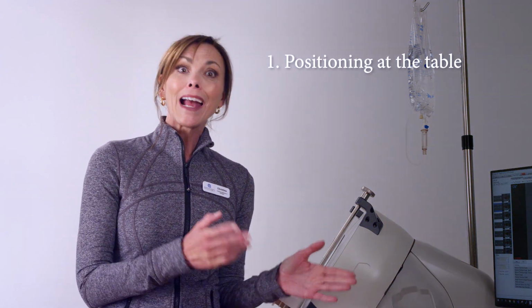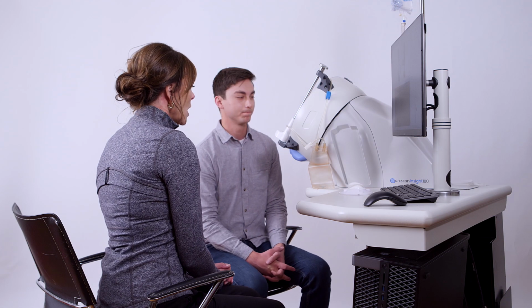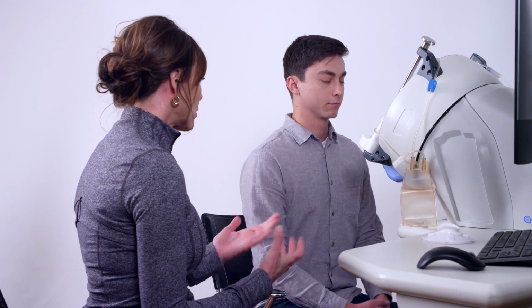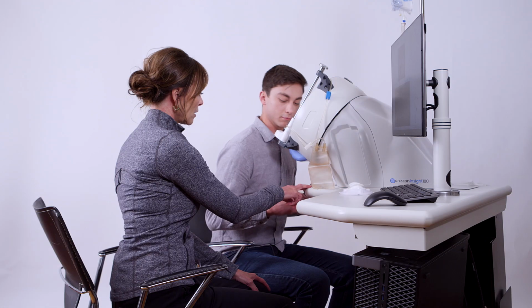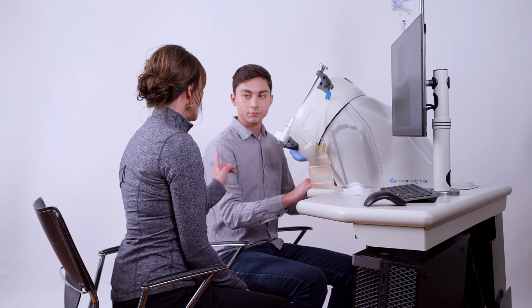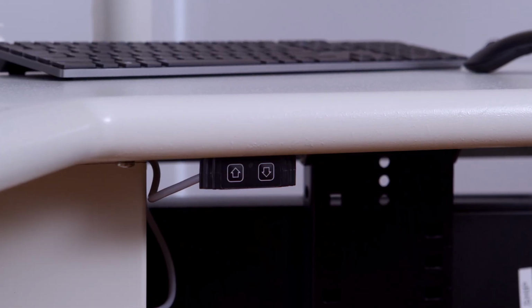There are two aspects to good patient positioning, a key to capturing the images that you want: positioning at the table and positioning at the EyeSeal. Generally, the patient should have good posture and lean in from the hips instead of hunching over. They should move in close to the table, feet flat on the floor. They can use these handholds to pull themselves in toward the table and to help them maintain their position during the exam. Raise or lower the table as necessary.